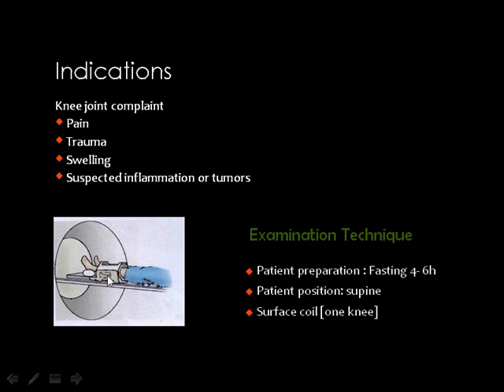The surface coil is put very close to the part to be examined, and the ideal surface coil does not move with respiration. What is the function of the surface coil? The surface coil is the apparatus which can take images. If you use the coil in the machine itself, it will be away from the knee, then you get very small images and bad resolution. But if you put the surface coil adjacent to the knee, then you will get a bright image and very good resolution.